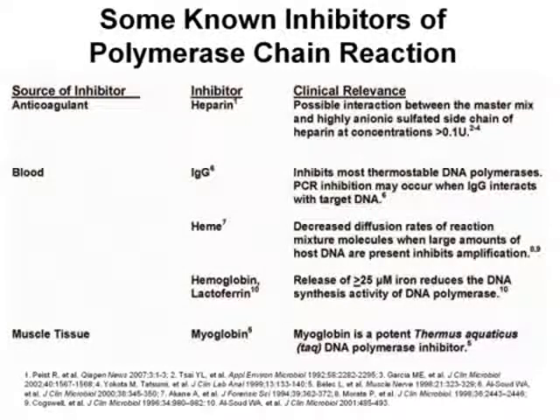Inhibitors can have differential effects that are concentration dependent. The concentration effect is particularly relevant when the actual inhibitor concentration is usually unknown. Inhibitors may have unequal effects on different PCR protocols. For example, one particular PCR reaction may be unaffected by a potential inhibitor, whereas another may be completely suppressed. Given this notion, when validating a new nucleic acid recognition device, considerations must be taken to understand the similarities of the intended reference method with the experimental method.